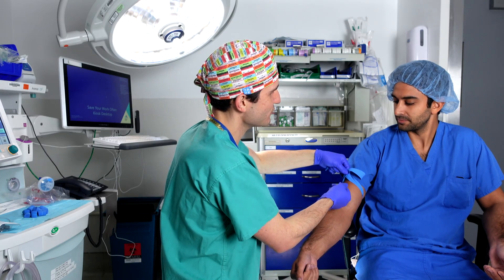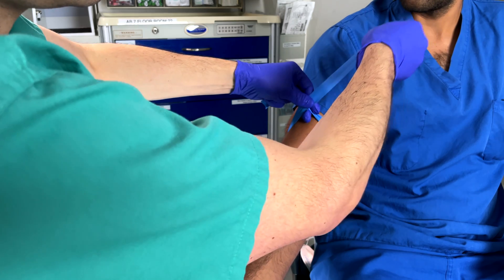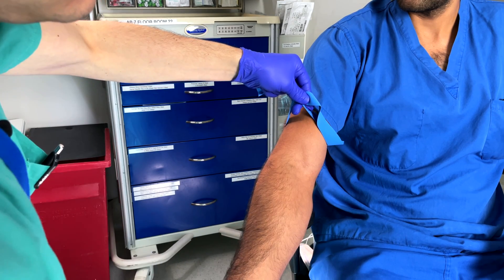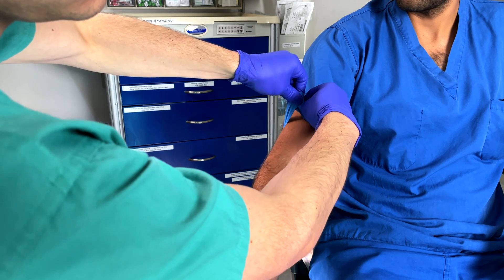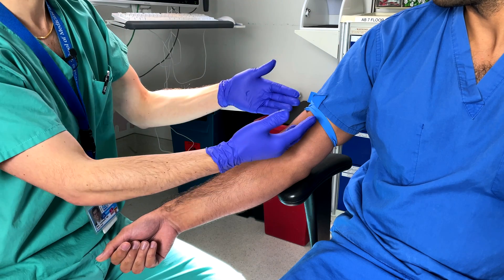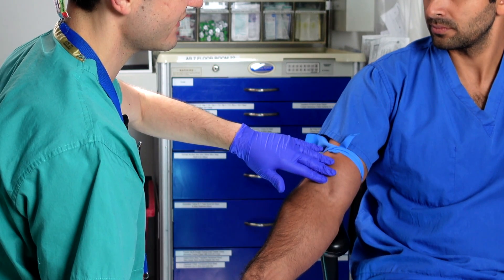That allows me to keep my right hand free to manipulate equipment and also to adjust the tourniquet. You can see that it's very easy for me to tighten the tourniquet by pulling on the end that is closest to me — I simply pull up like this. Then I can maintain that tightness using my thumb and index finger on my left hand. Once I've gotten to the desired level of tightness, I go ahead and tuck this in underneath this loop here using my right hand, which maintains the level of tightness. I also want you to appreciate that that keeps both ends facing away from the area where I intend to do my venipuncture.